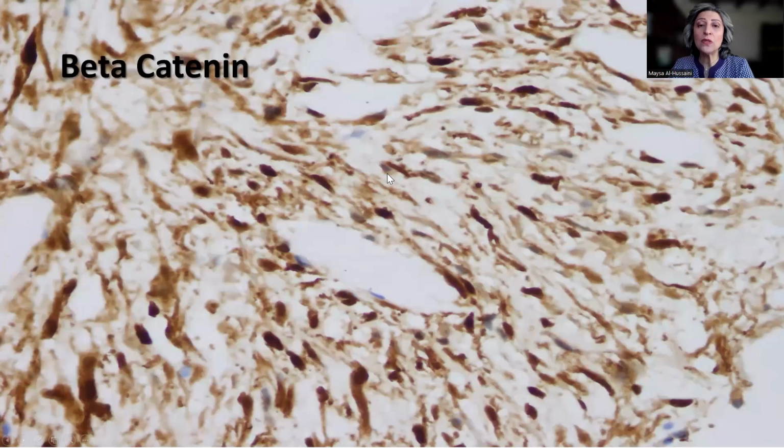And these tumors are usually focally positive with smooth muscle actin. But really the diagnosis nowadays relies on the confirmation by beta-catenin. Now, beta-catenin is normally expressed in the cytoplasm and cell membranes of cells. So the presence of cytoplasmic positivity in the processes on the cell membrane is normal. We cannot read it as positive. What is really positive in terms of the mutant beta-catenin is the presence of a nuclear staining.